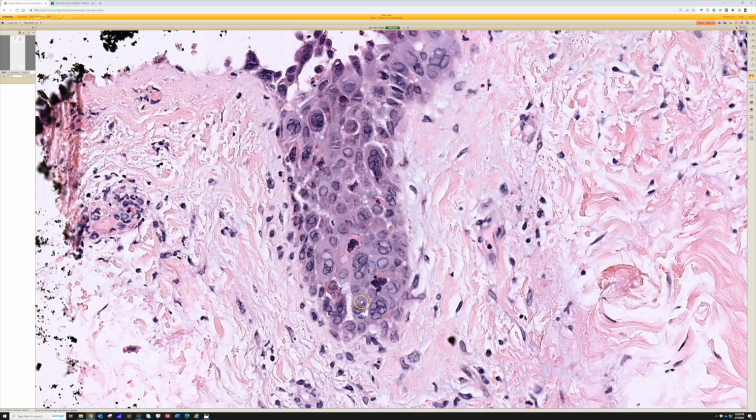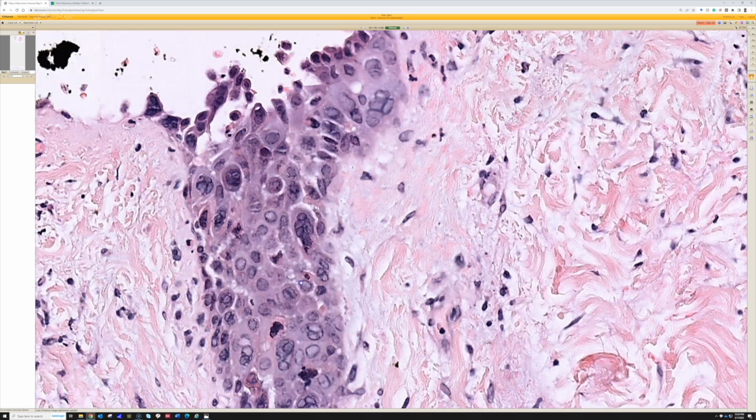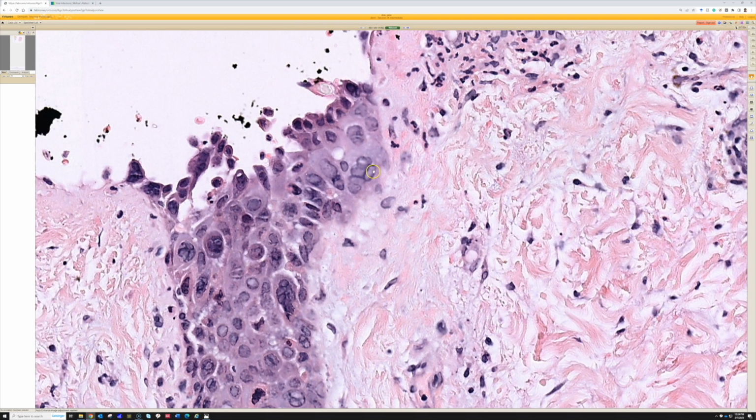But this is a perfect example of the 3 M's of herpes, and some people will make a 4th M and say mega cells, meaning the cells are really big and large because they are enlarged. The central part of the nucleus has this kind of hazy ground glass, I'm using air quotes here, or frosted glass appearance, that smudgy kind of gray look, and that's because I think they're filled with viral particles, and then the DNA gets pushed out to the side and compressed along the margin of the nucleus, along the nuclear membrane. It looks like someone took a dark purple marker and drew around the outside of the nucleus. So those are the classic cytopathic changes of herpes.